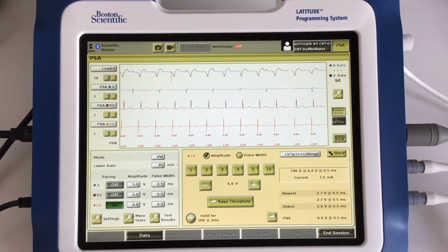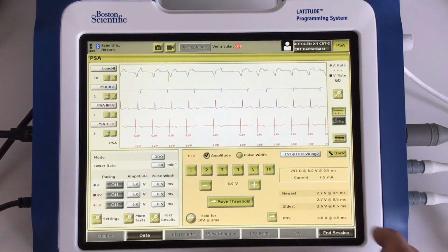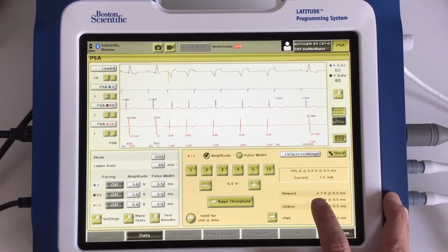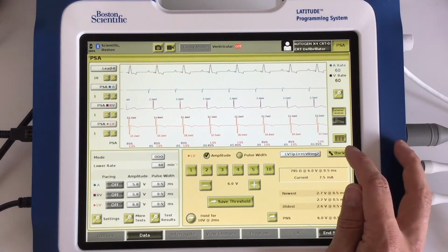So let's wean off and then stop our pacing. So using this vector, our impedance is okay. Our threshold is a bit high and we've had twitching at relatively low output. So let's try some different options.